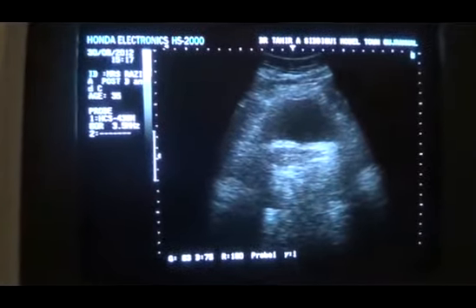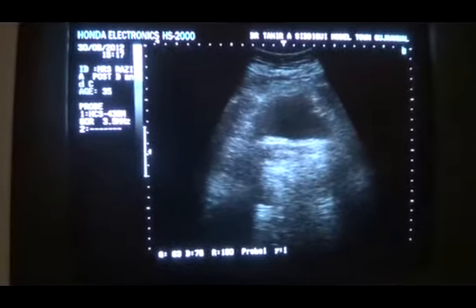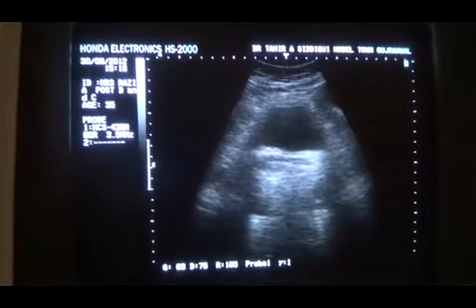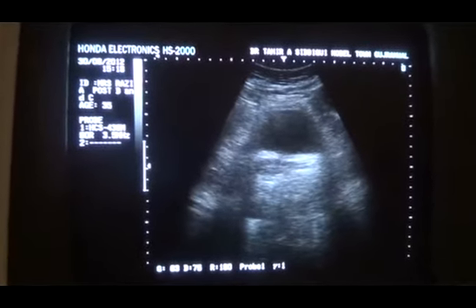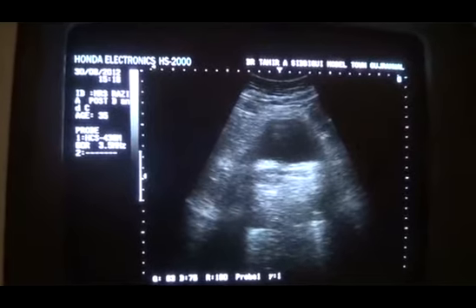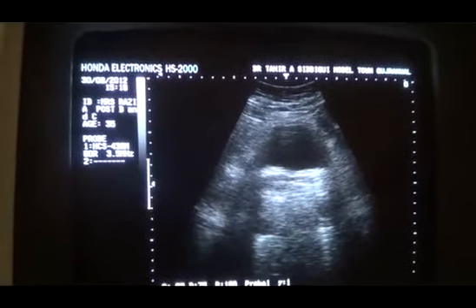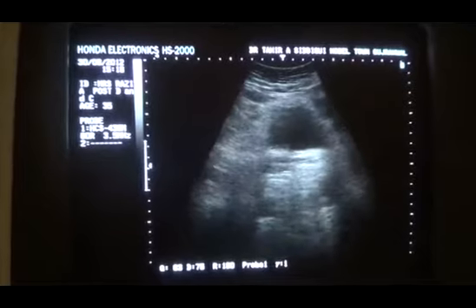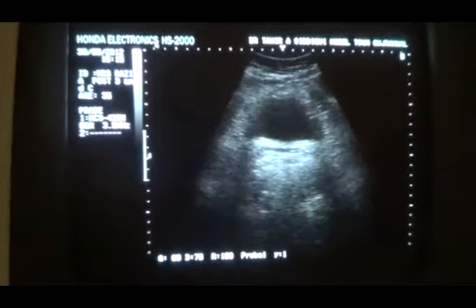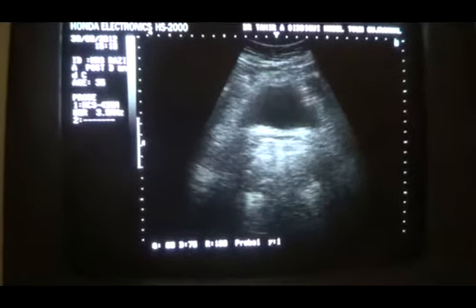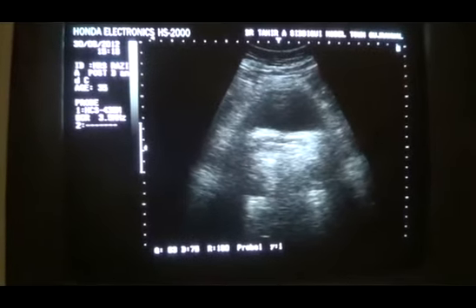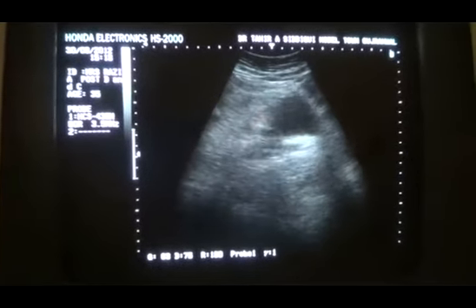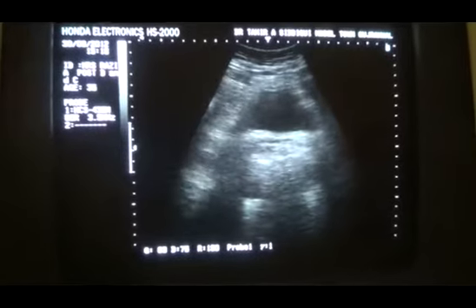We are going to scan a patient aged 35 years. She had a DNC of a 5-month pregnancy. Yesterday the DNC was performed and now she is complaining of severe generalized abdominal pain with passage of clots.